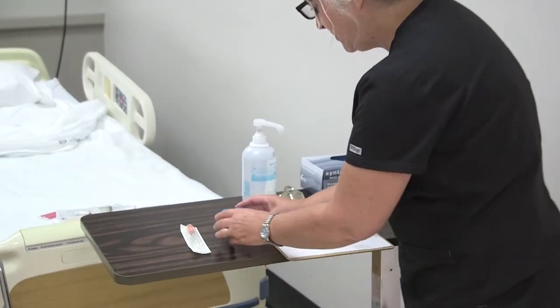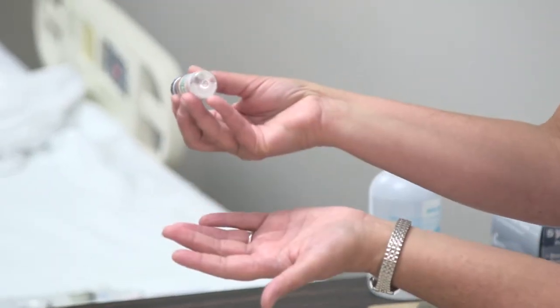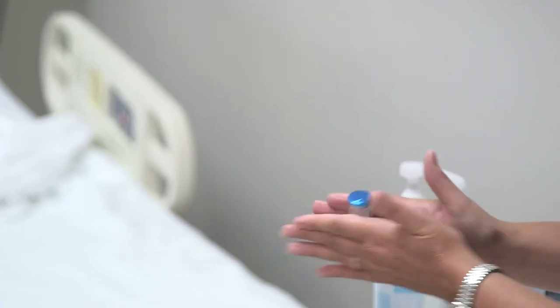The NPH insulin is cloudy — as you can tell, that's normal. You just want to make sure you rotate it a little bit to get it all mixed together before you draw it up.